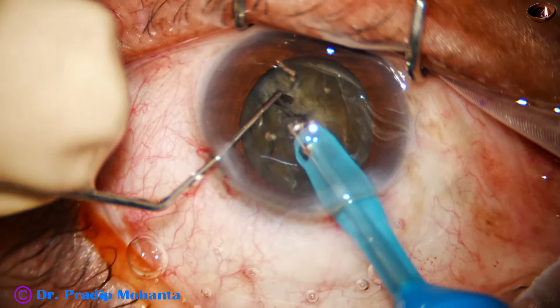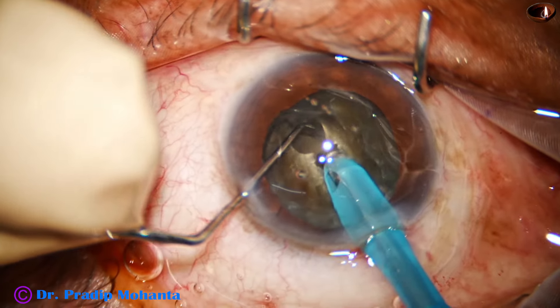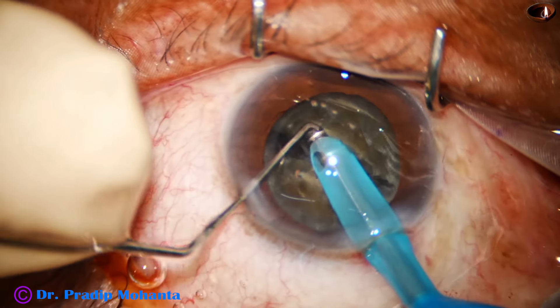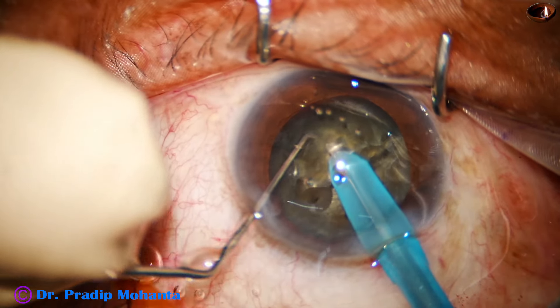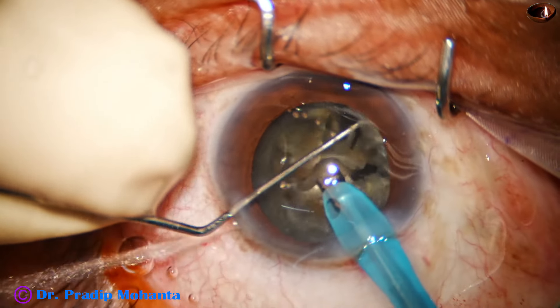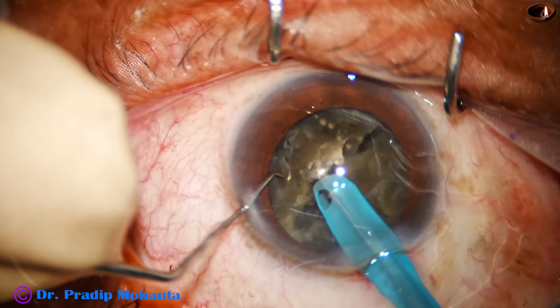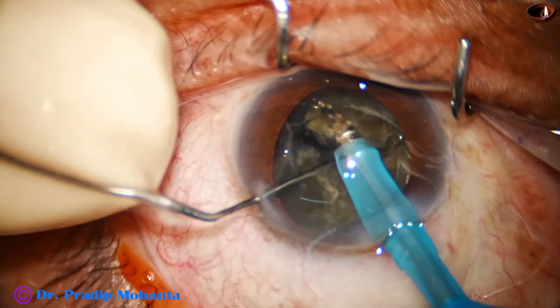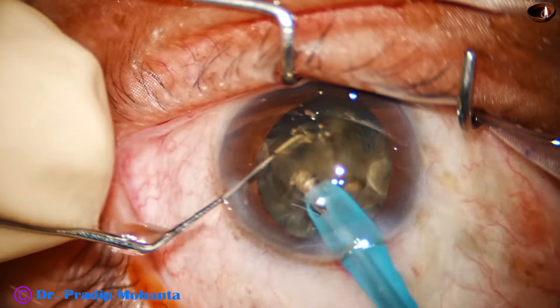The chopper is used to make a very good crack. The nucleus is rotated 180 degrees, a secure hold is made on the heminucleus, and the other half is separated completely. Now we have two free heminuclei. One heminucleus is then subdivided into two free fragments. I rotate, come to the other heminucleus, attack the belly of this heminucleus, go through the substance — and this is the complete division of the nucleus into four large fragments.